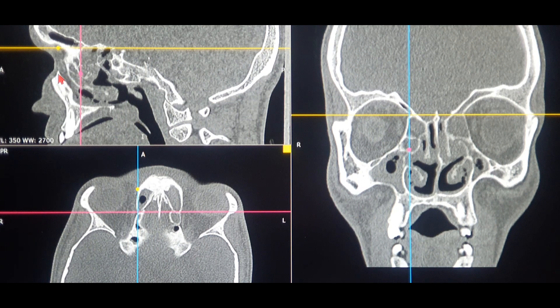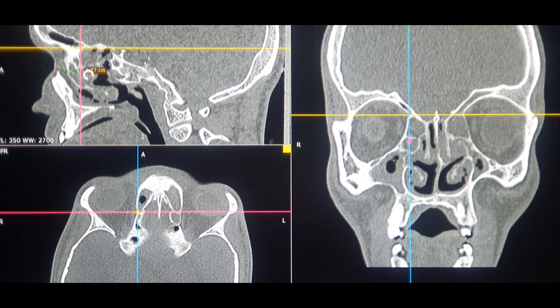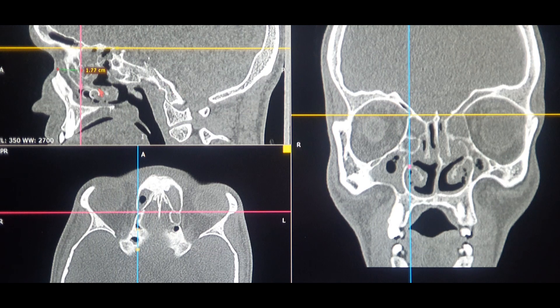If I draw a margin from the anterior lacrimal crest to the anterior ethmoidal artery, this patient is showing a variation of approximately 1.77 centimeters. The normal range should be 2.4 centimeters — 24 mm — but this patient has a variation, and the anterior ethmoidal artery may be placed somewhat anteriorly. The rough area is around 2 to 2.4 centimeters, and in this patient it is roughly 1.77 centimeters, which may also vary on the sagittal scan depending on angle.